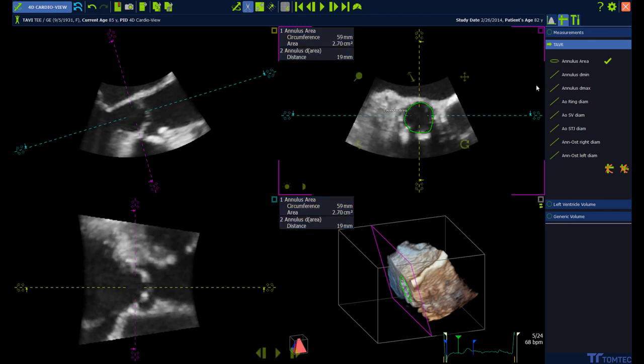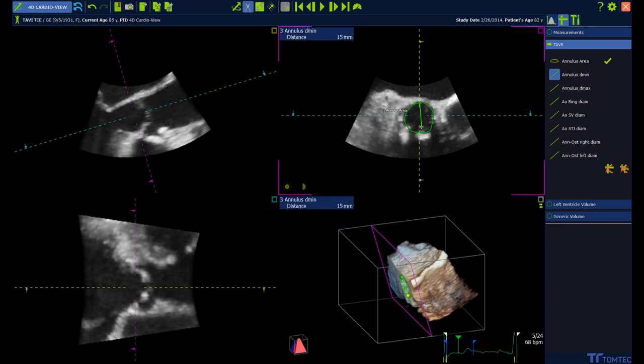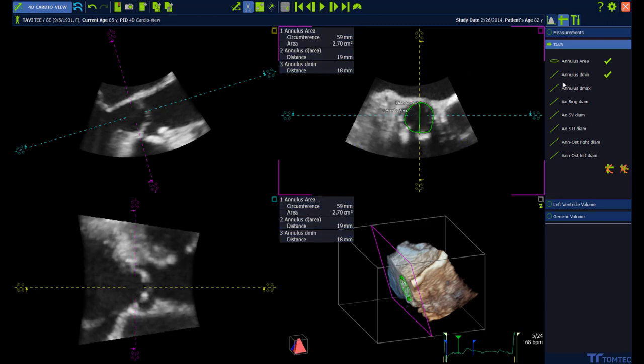Go for the next measurement. Same way again — left mouse click and left mouse click. You can also change it afterwards if necessary.